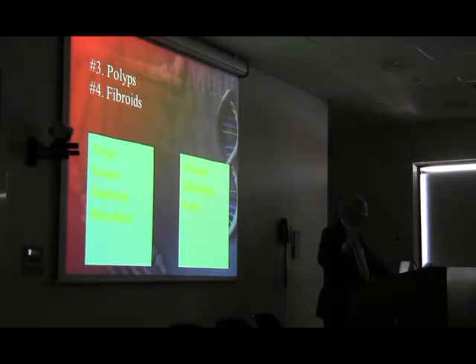So I won't talk too much about the morcellator, except to say that if you want to use the morcellator for fibroids, it's a different kind of fish. It's a very good gadget to suck out a polyp in about 10 seconds, but to work out a fibroid is different. I've done a few and it's hard work. When you're listening to Mark, just think about the difference there. He's trying to pass it off as just doing everything, but ask him about it.